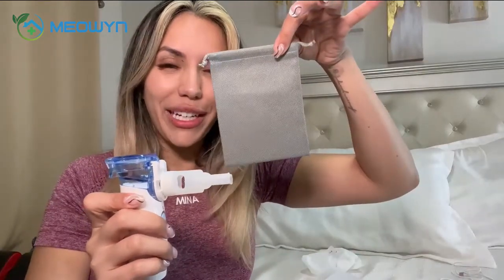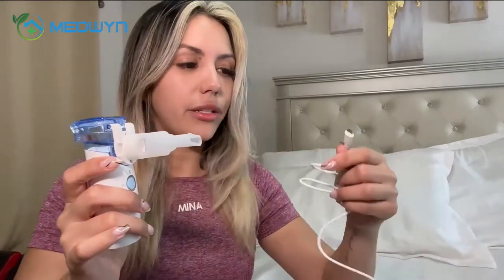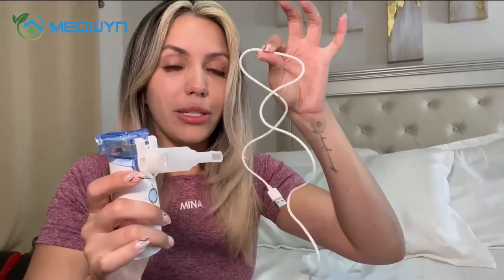It also comes with this little carrying pouch and it's battery operated. You do have the option to connect it to a power bank via USB or plug it in, but you have to have it plugged in if you're going to do that option. Or you can go wireless and use the battery operated feature.